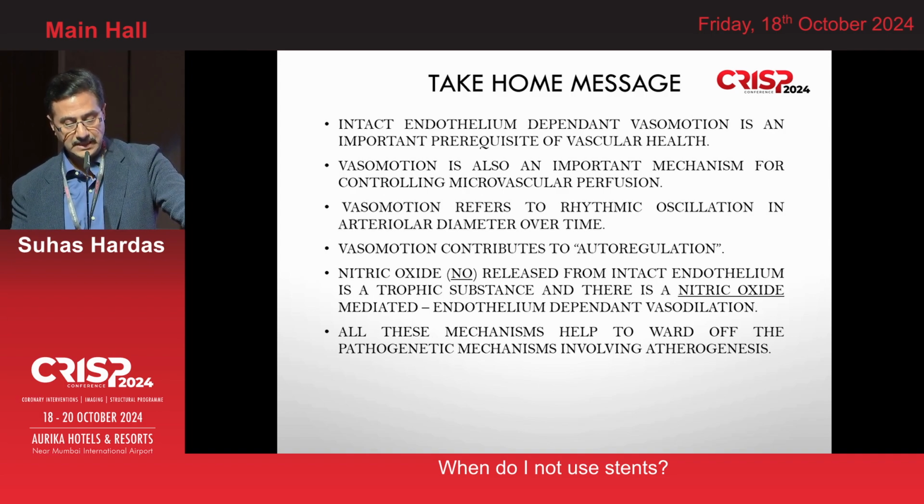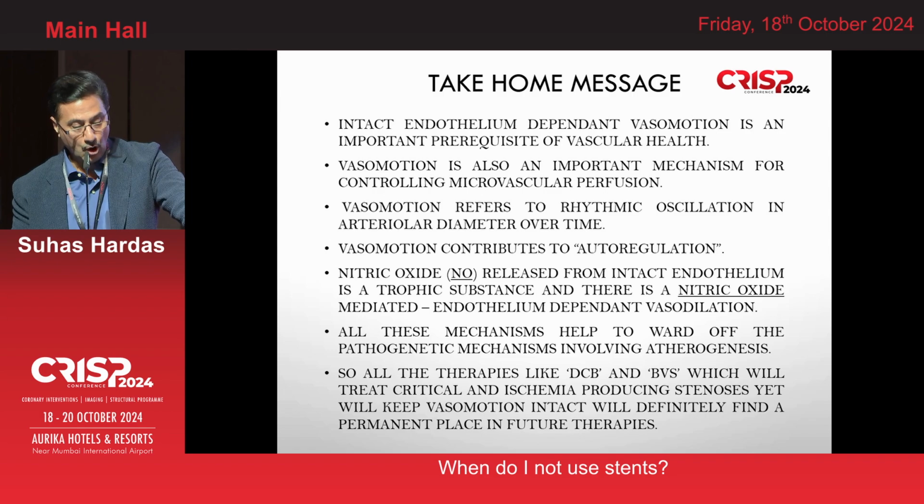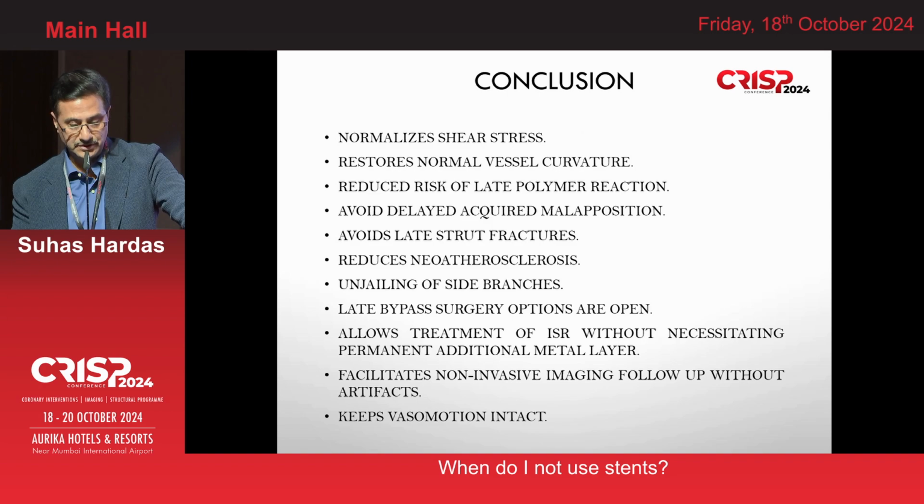All these mechanisms help to ward off the pathogenic mechanisms involved in atherogenesis. So all the therapies like DCB and BVS, which will treat critical and ischemia-producing stenosis, yet will keep vasomotion intact, will definitely find a permanent place in future therapies.